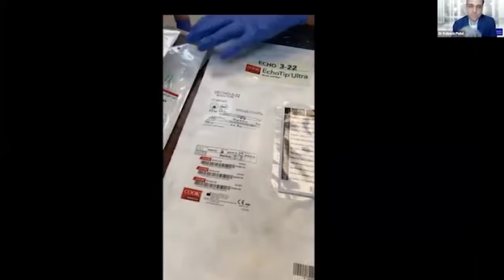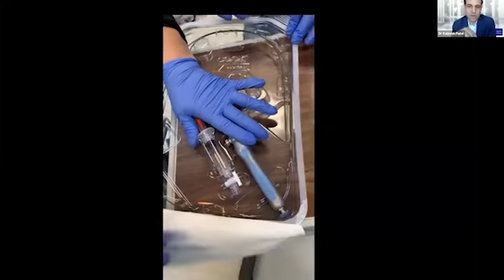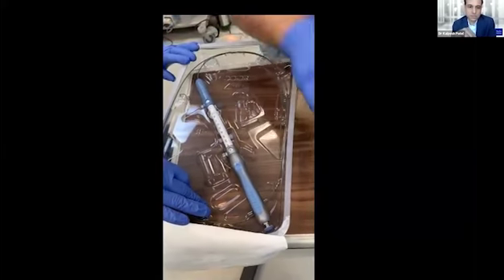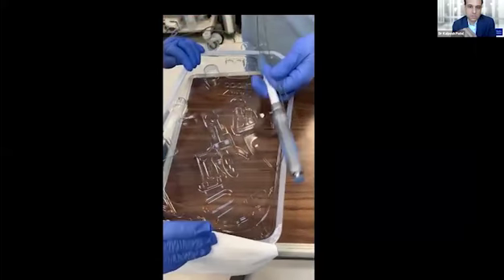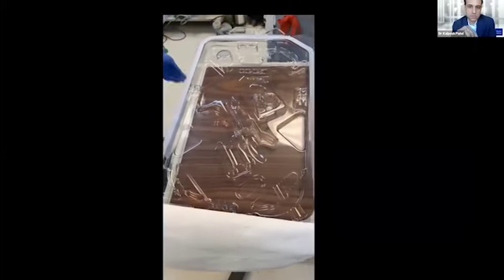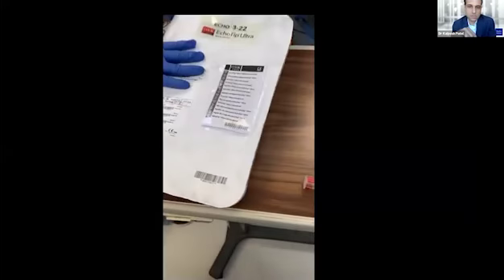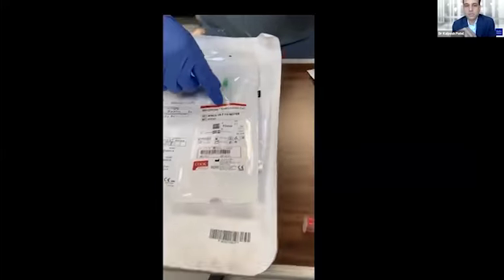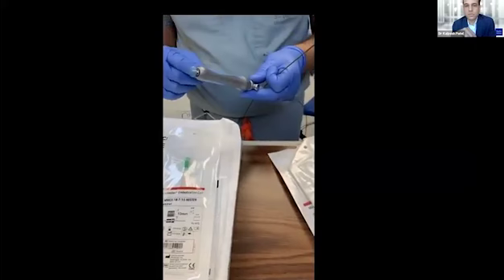So my assistant here, we're going to go ahead and get started. You can open the needle, please. So for this, we're not aspirating, so I always put this aside to avoid any confusion. We're going to take the needle. And I like to begin by prepping the needle before handing it to the endoscopist. So the way to do that is we're going to require a saline flush. So while we get that, the basic idea is we're going to transfer the coil from its packaging from this catheter into the hollow lumen of the needle.